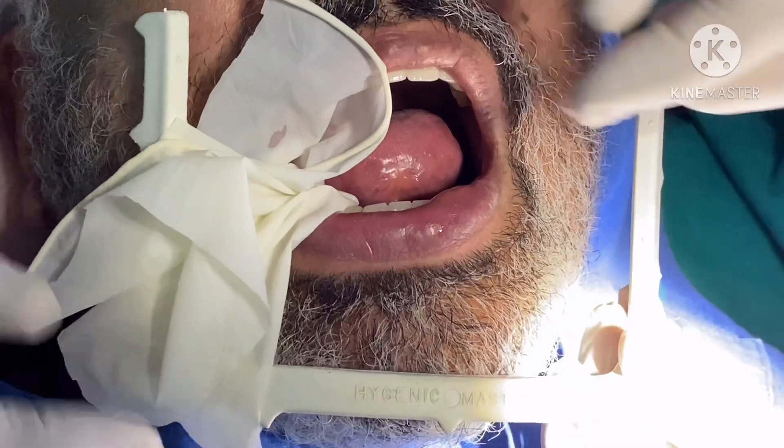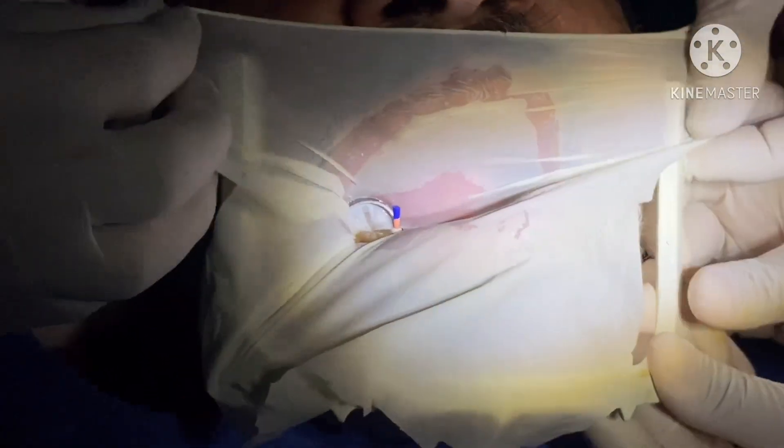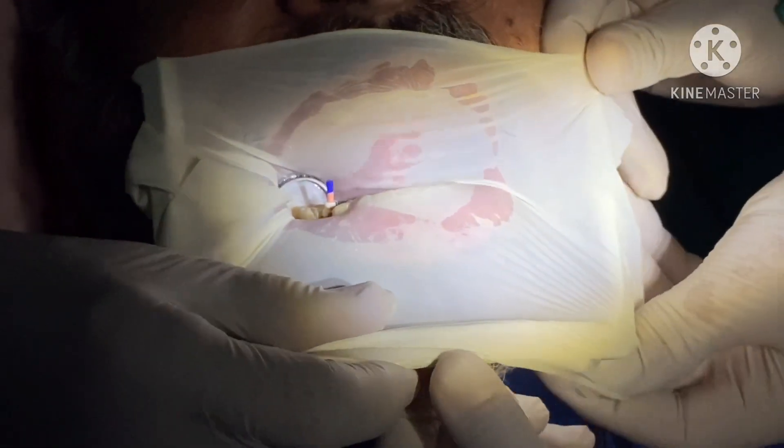After the x-ray, we just unfold it and repeat the same procedure of applying the rubber dam.